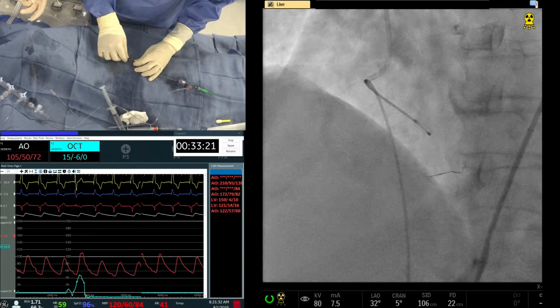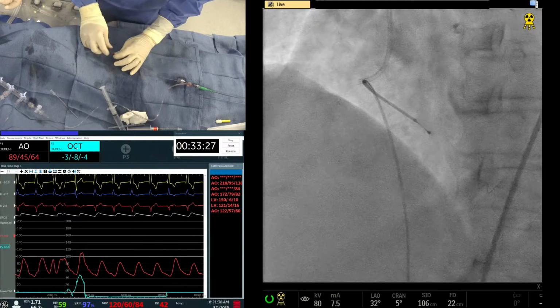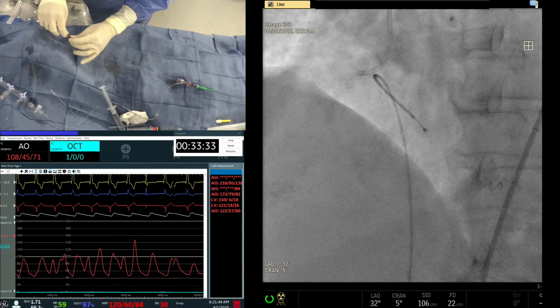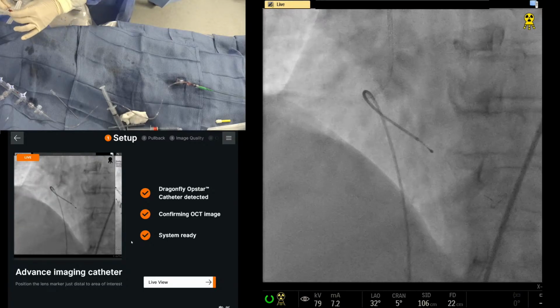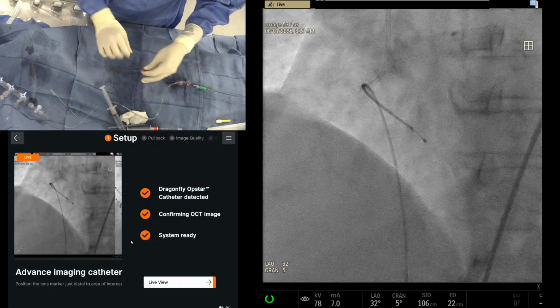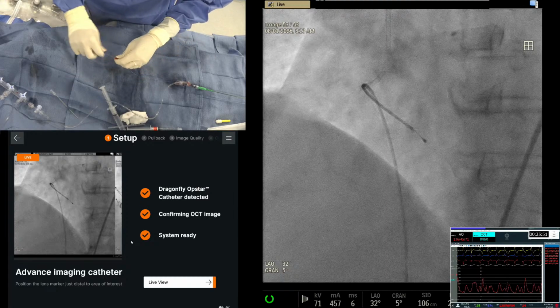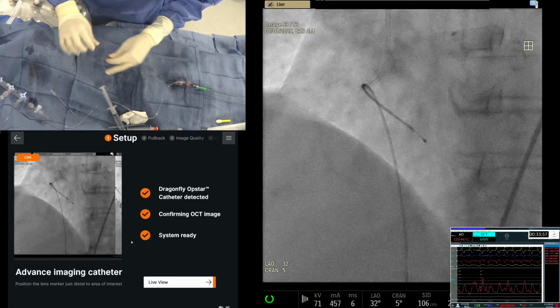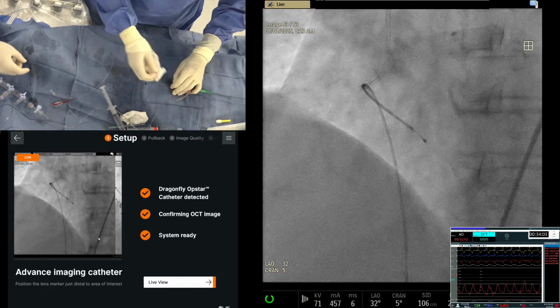Okay. Coaxiality is our friend. Yes. Okay. Now let us see. Get us the OCT. So he's preparing everything, right? Imaging wise, how do you prep from your side? No, prep is perfect. Just make sure this is like a 90% lesion, OCT might not cross. And the most important point is the third P, like puff. We should see a good clearance of the blood. If it's not good, we might need a pre-dilatation because it's most important to get the image. But anyway, we can try now.